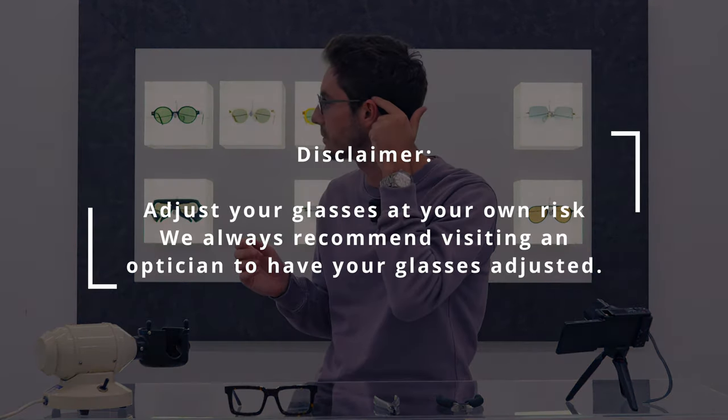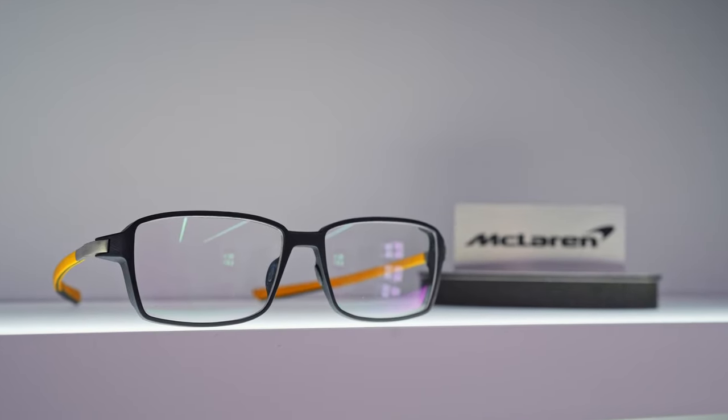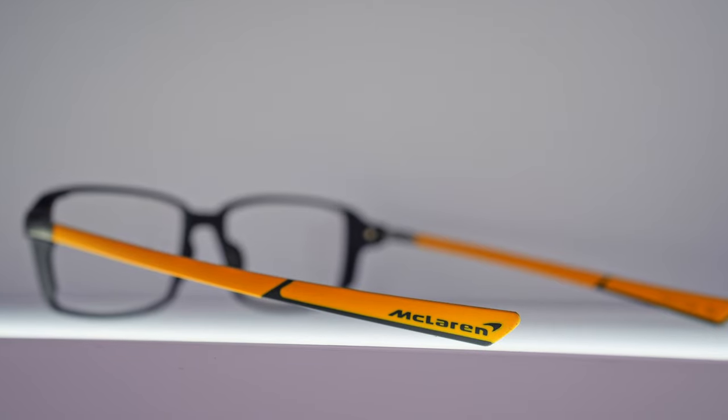What we want to see here is a temple tip that curves gently around the back of the ear. You never want to see a 90-degree angle — that's never a good sign. You rarely want to see temple tips which have no grip at all, unless it's a straight-fitting temple. Those do exist with brands like Oakley, McLaren, Carrera, etc. The majority of glasses do need to be fitted around the ear to keep them in place.